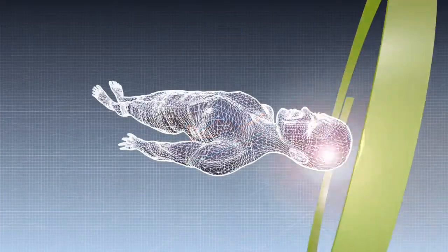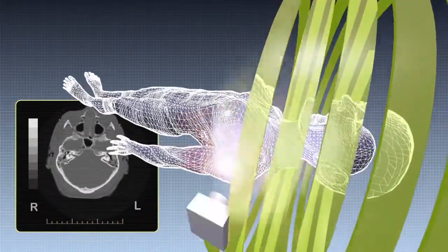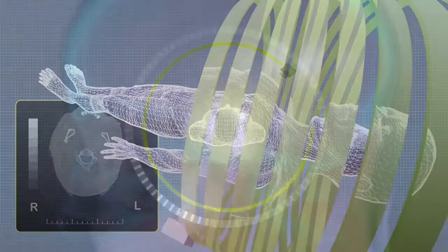A scanning apparatus rotates around the patient, aiming spirals of x-ray beams at whatever section of the body is being scanned.